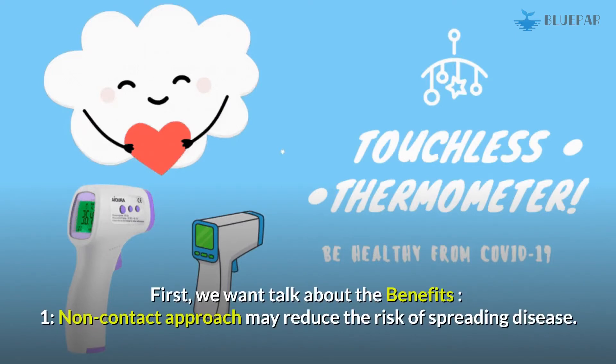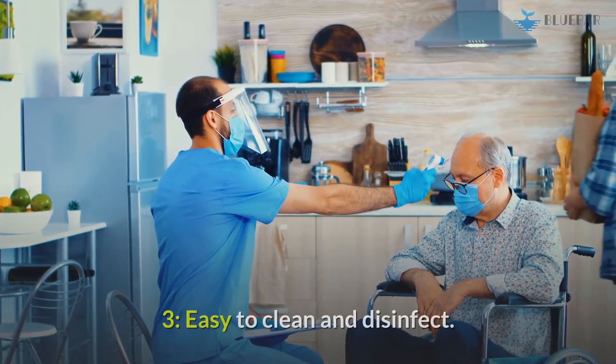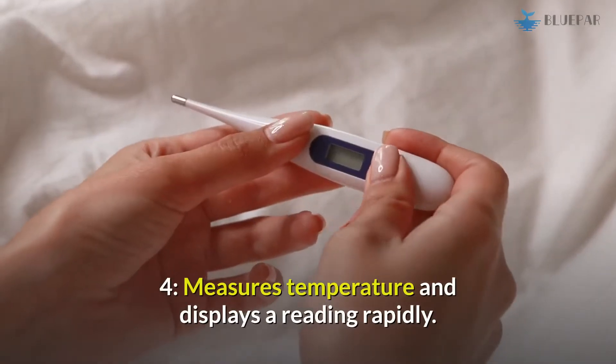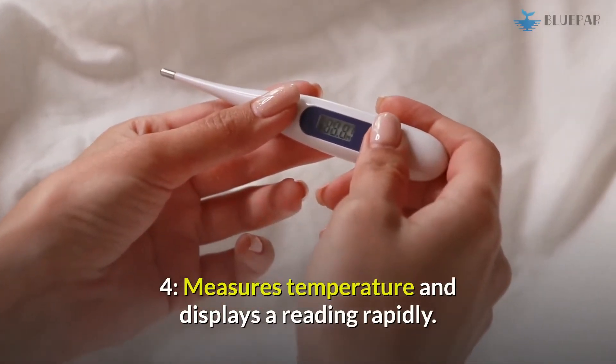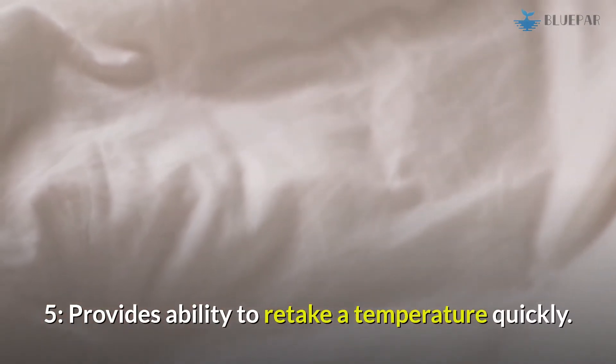Let's talk about the benefits of non-contact infrared thermometers. First, the non-contact approach may reduce the risk of spreading disease. Second, they are easy to use. Third, they are easy to clean and disinfect. Fourth, they measure temperature and display a reading rapidly. Fifth, they provide the ability to retake a temperature quickly.